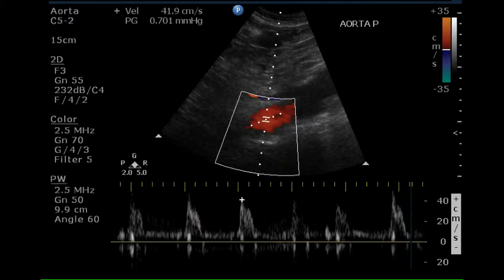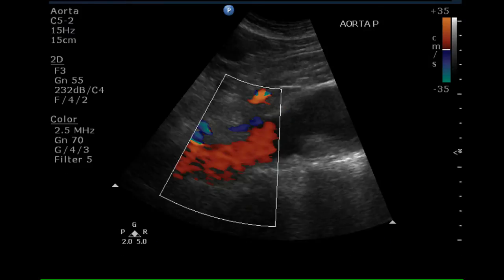The pulse Doppler signal is normal indicating low resistance flow. There is continuous blood flow throughout the cardiac cycle in this portion of the aorta, which is normal. Another color Doppler image of the proximal aorta demonstrates that it fills completely with moving blood.